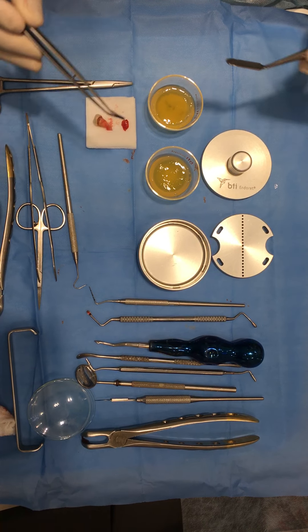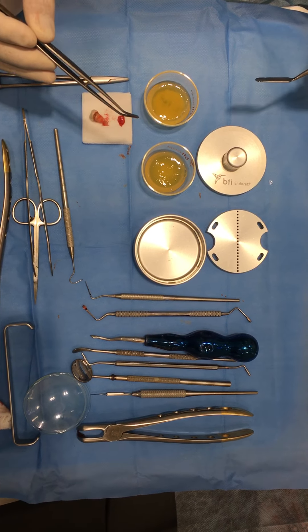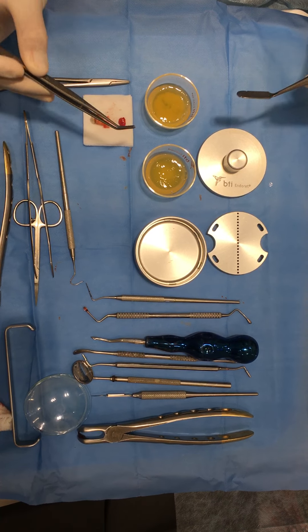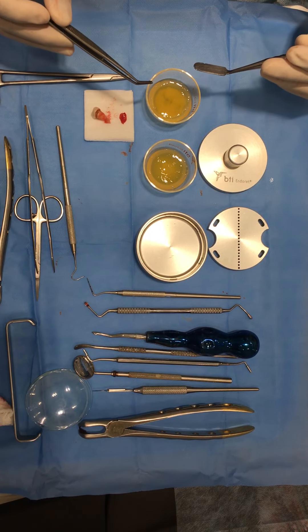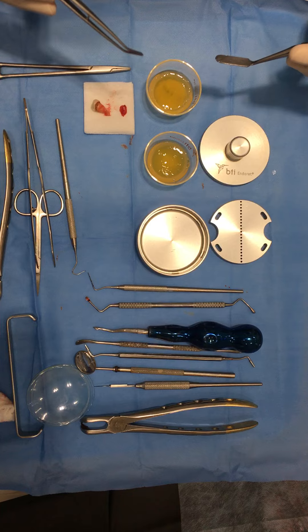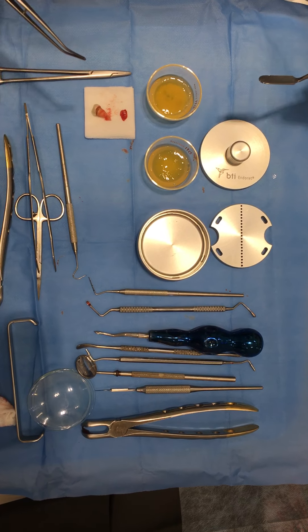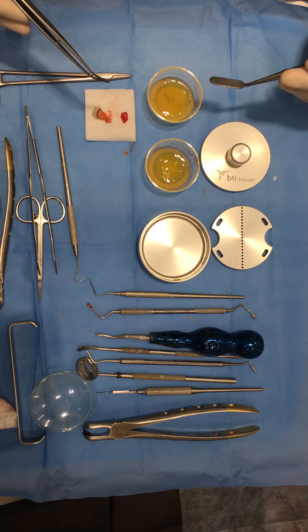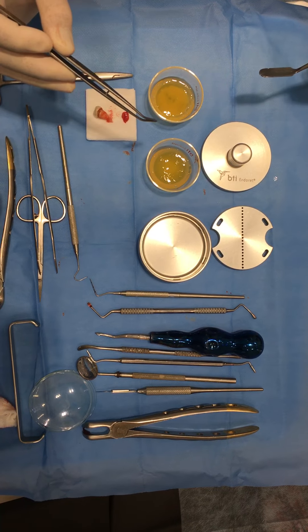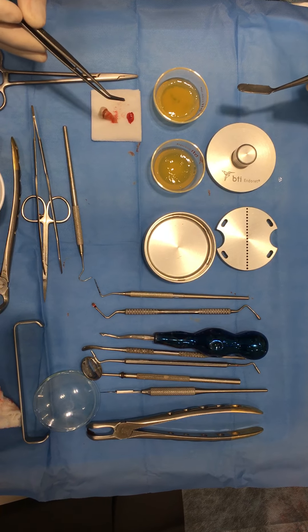Then we're going to make some specific sutures to ensure that the graft is stable. The agglutinative properties of the growth factor therapy will allow us to ensure the integrity of the graft throughout all the time it's needed. In this case, we're going to wait six months, and then we will retake a CBCT to plan our implant.